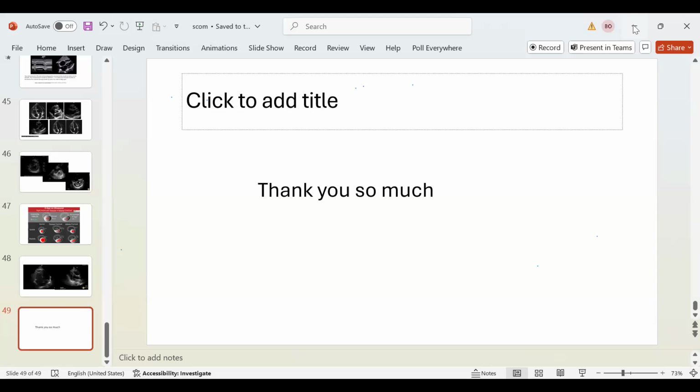Thank you, Dr. Hatim. It is great to be here. I will just say that CMR is the gold standard for volumetric assessment of LV and RV, especially the RV. But still the gold standard imaging in cardiography is the echocardiogram, and so any cardiologist has to master echocardiogram.